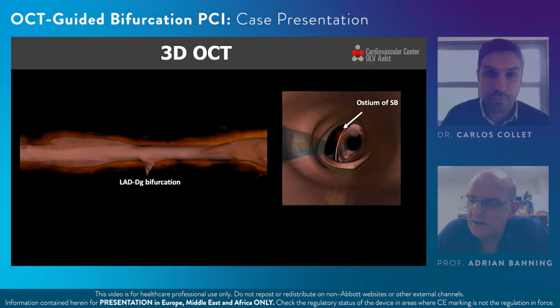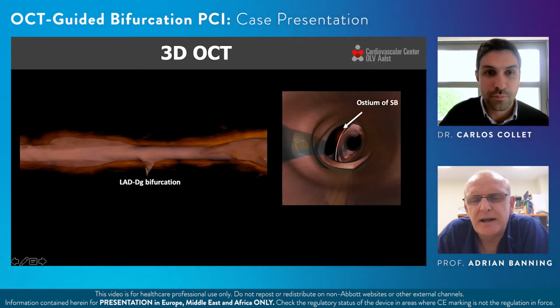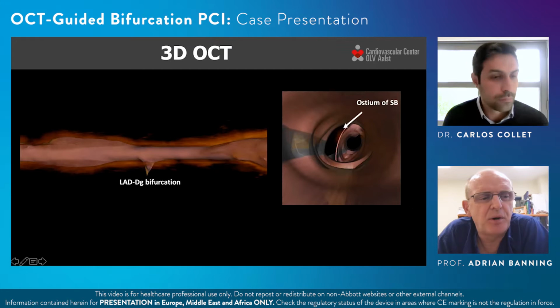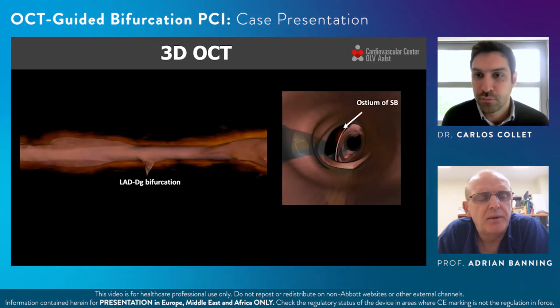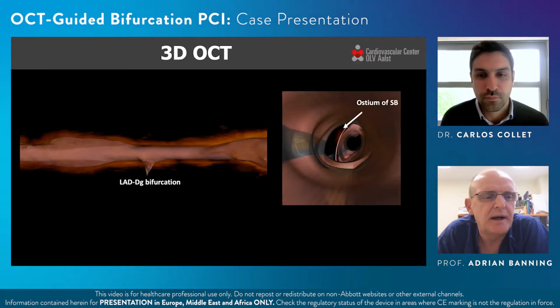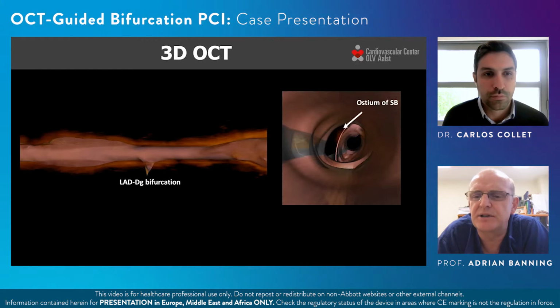Great, thanks, Nicholas. I guess the key question for me here is whether the initial stents are properly expanded or not, and what the contribution of in-stent restenosis is. It's interesting that this is a long time since the stents were placed, so it's a slightly unusual presentation. This is some 10 years or so, I think, since the original stents.